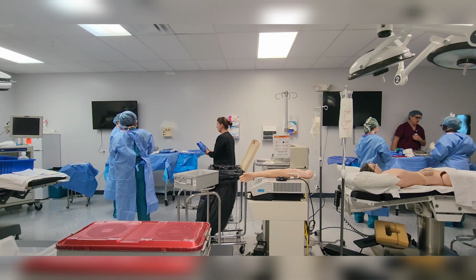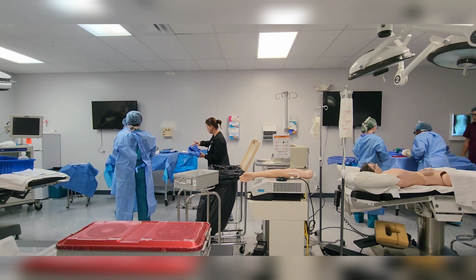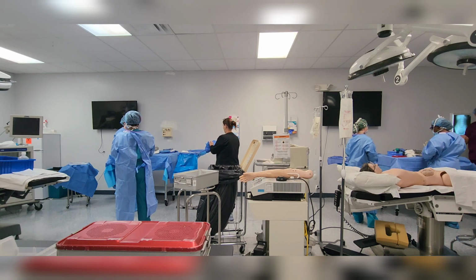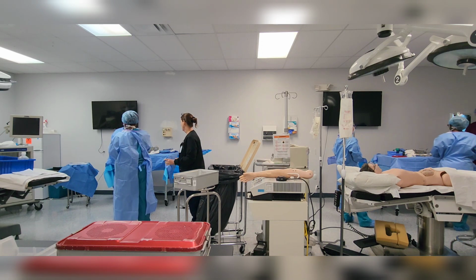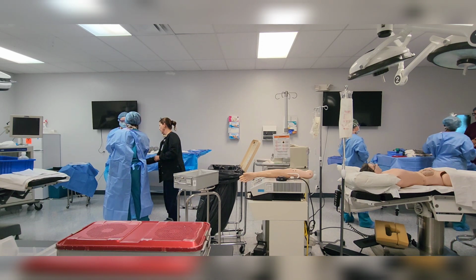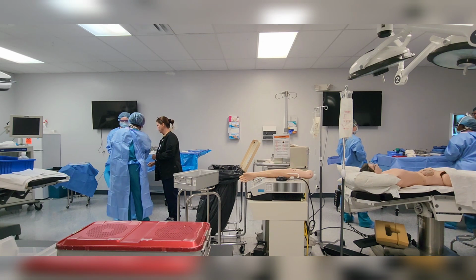And then just a knife. Handles a little bit lower, Sarah, so that she doesn't have to go up like this, so that she can just go right in. Do you want to add to the count? Suction? How many total suctions do we have? We have... keep your finger back. One, two pieces. Three in total, right? Keep your thumb back. There you go. I agree with that count.